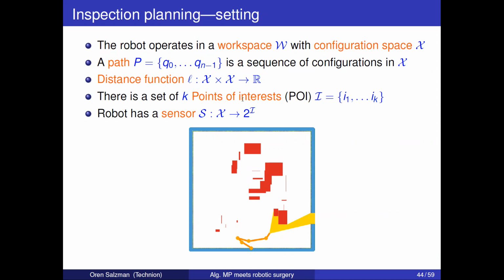Initial approaches simply said, okay, let's sample a bunch of points until we collectively see the entire set of points of interest. And then let's run some variant of TSP with neighborhoods that collects these points. This is the orienteering problem. So there are different versions of what you exactly want to optimize.